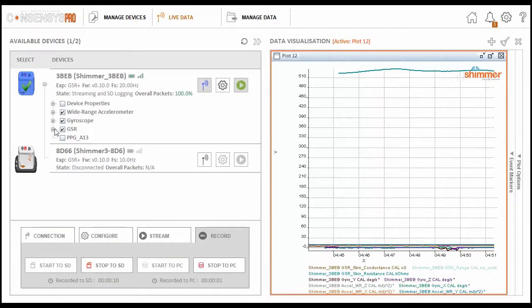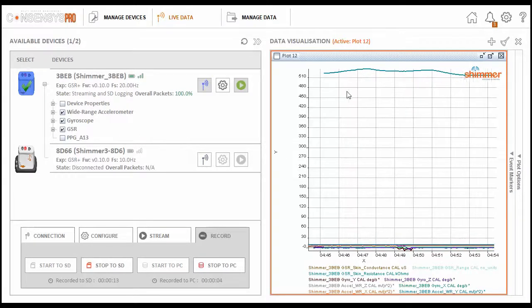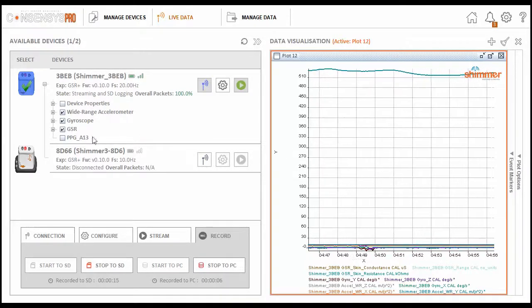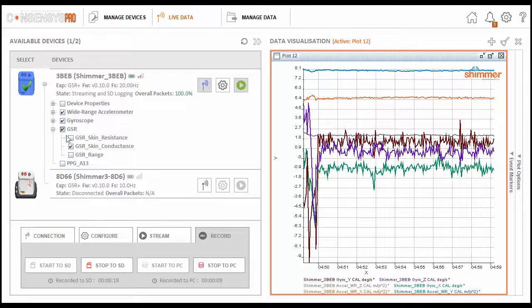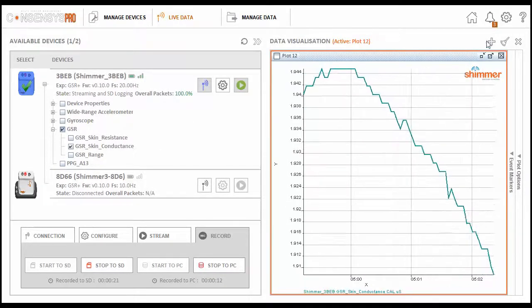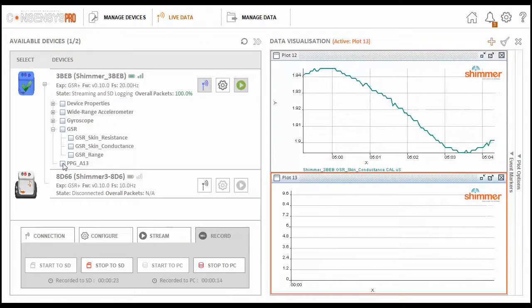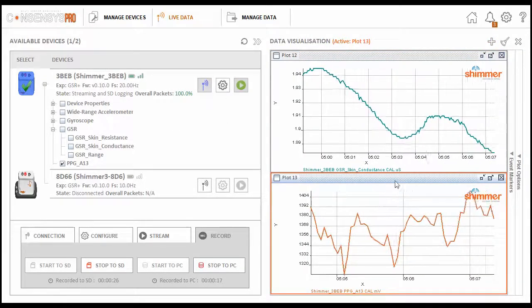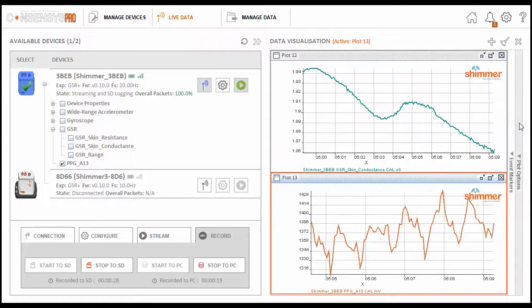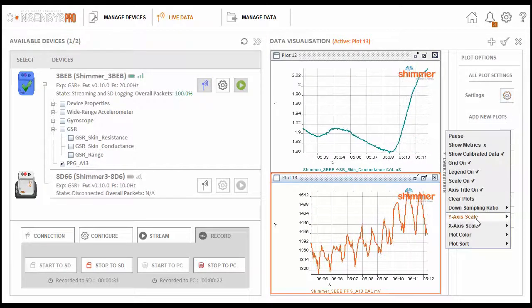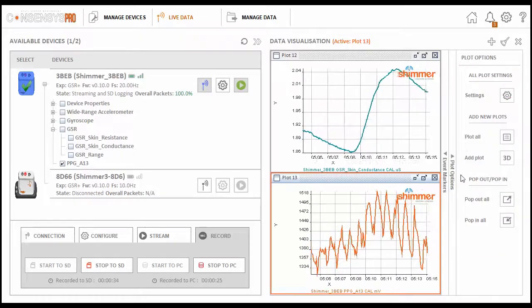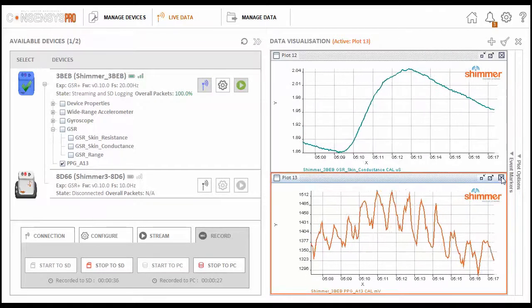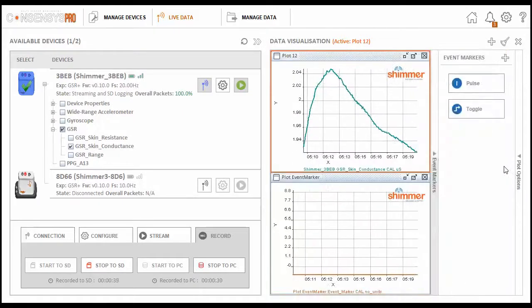There are a number of different options for plotting the signals. We can have all signals on one plot, or we can have different signals on different plots as we wish. The plot settings can also be configured to your needs, such as changing the X and Y axis scale range.